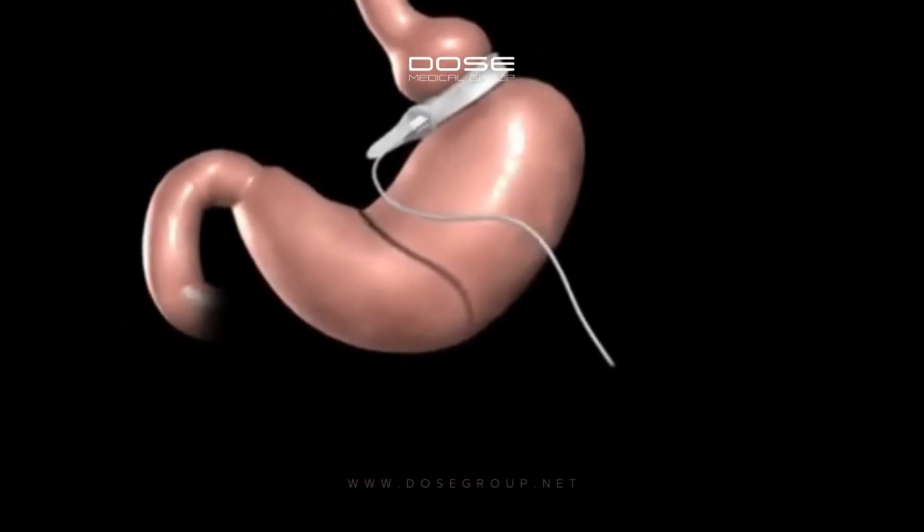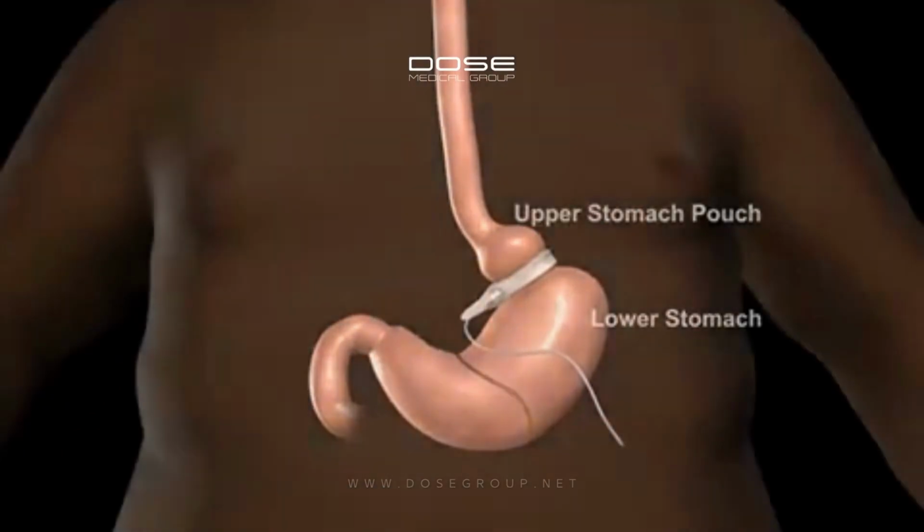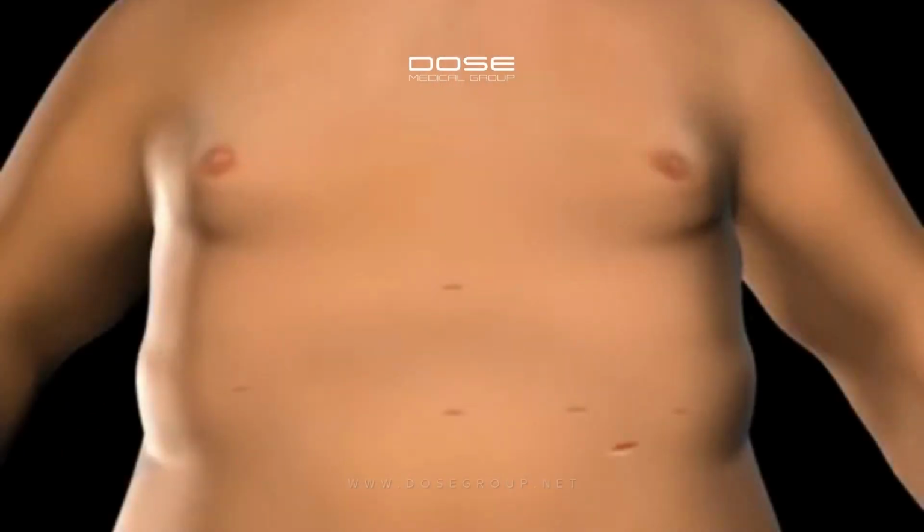A tube attached to the Realize band will be connected to the injection port. The port is used to adjust the band tightness after surgery.